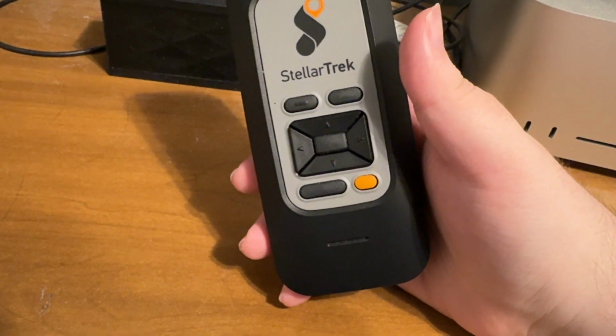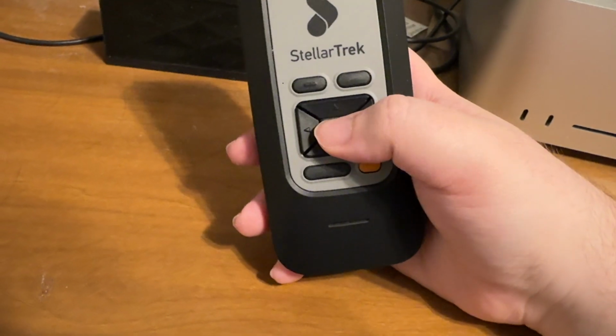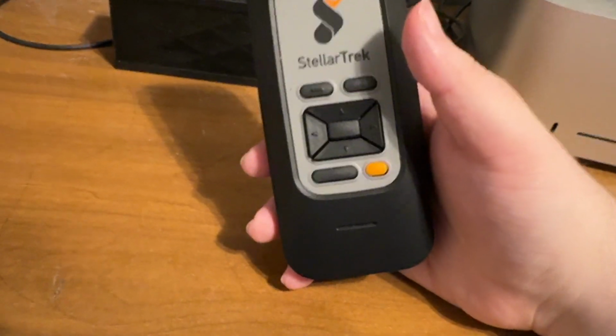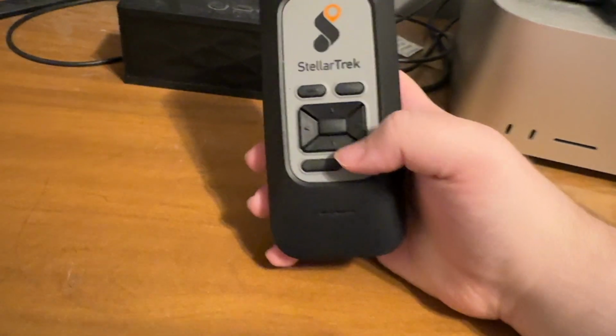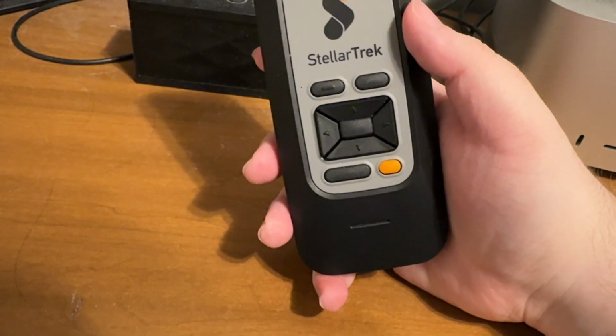Remaining time, 1 hour 26 minutes. So it'd take us an hour and 26 minutes to walk this. Press confirm to cancel the route. Route deactivated. But that is the process for entering an address and managing it.